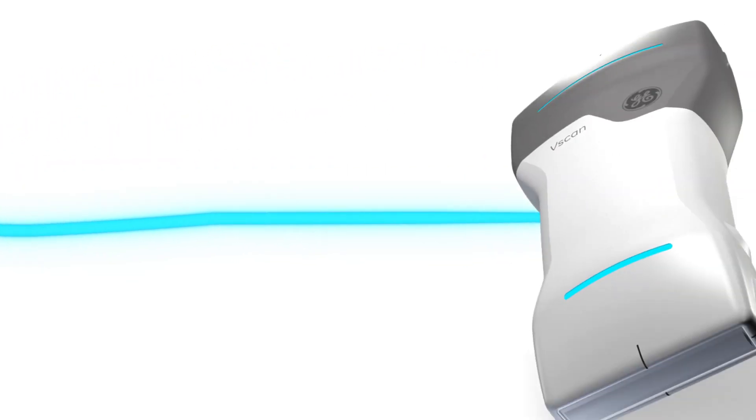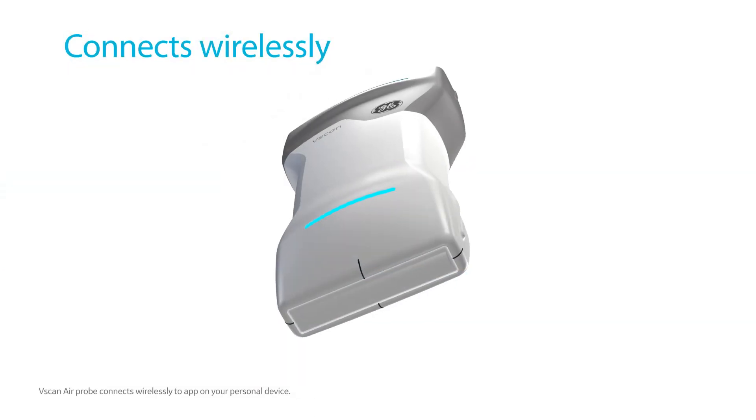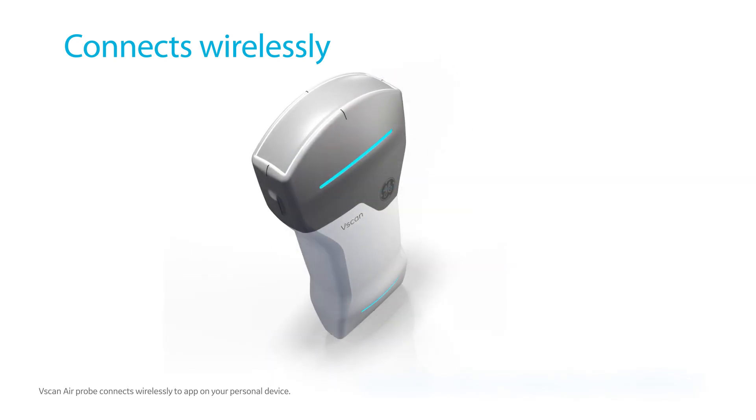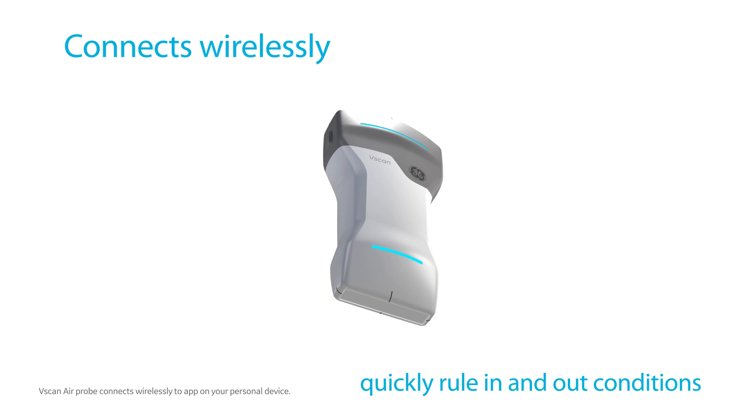See into the whole body with a simple flip of the two-sided probe. vScan Air connects wirelessly to your personal device and supports you in quickly ruling in or out certain conditions to accelerate treatment decisions at the point of care.